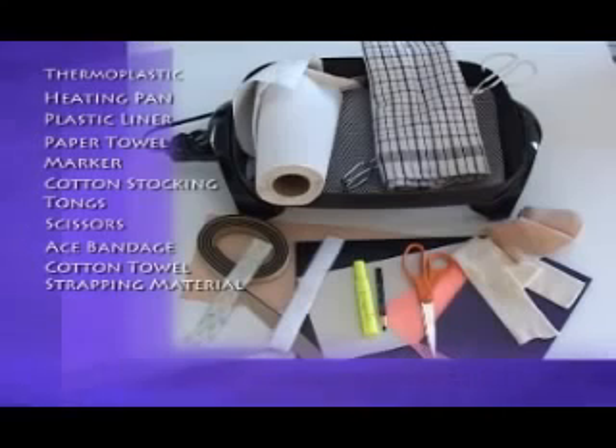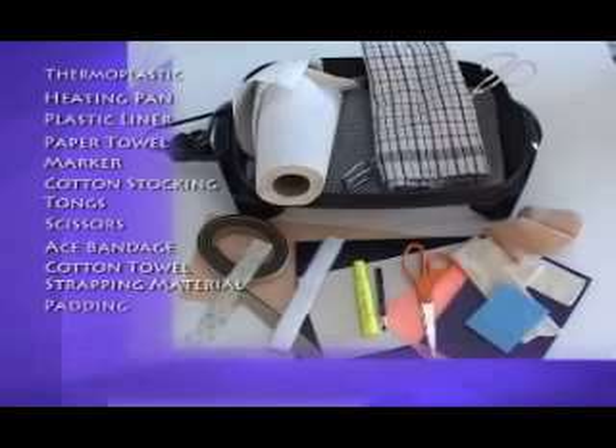Strapping material, available through Jorgensen Laboratories, is used to fasten the splint to the animal's limb. Padding material, also available through Jorgensen Laboratories, is sometimes used to protect bony prominences or delicate skin areas.